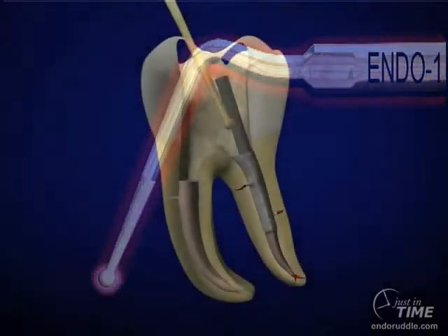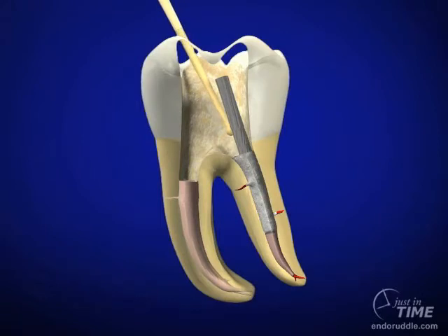The clinical feature of this means that if you hit the post in a glancing, back-and-forth brushing manner, you won't transfer energy nearly as efficaciously. If you rotate the head of your handpiece just 90 degrees, then it's like a fighter throwing a punch, and you'll see and hear and feel a lot better energy transfer from the ultrasonic tip into the post.